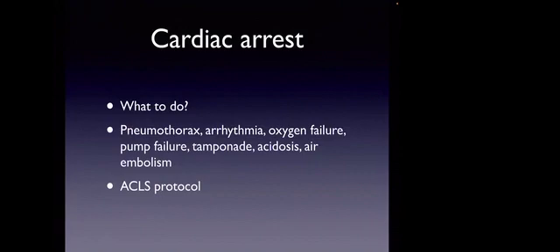of air embolism. If air is getting sucked into the circuit because of either a breach or there is some port which has become inadvertently open, air gets sucked in, and you can see air bubbles in the pump head. And that's where you suspect air embolism, which can be fatal. Sometimes you can also see clot in the pump head, which can also cause the pump to suddenly stop and lead to cardiac arrest.